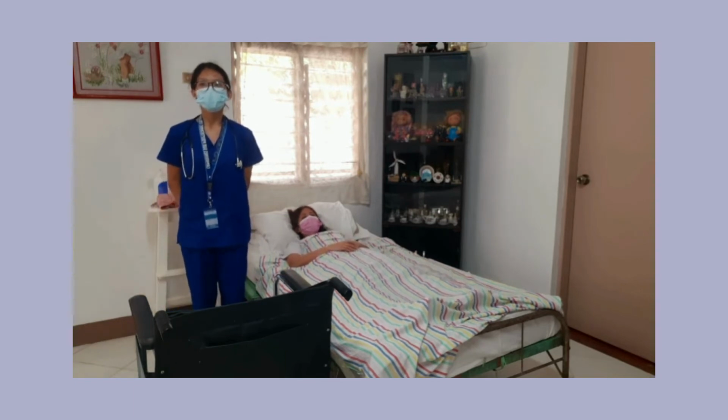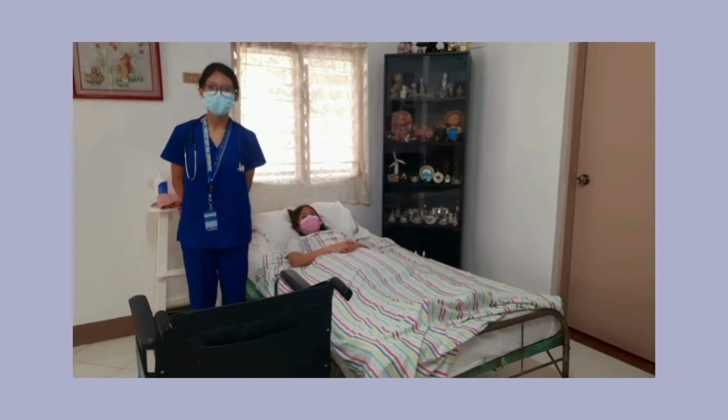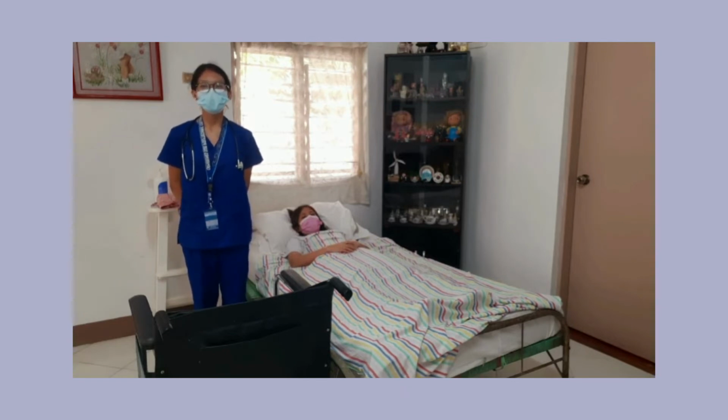Number 5, prepare and assess the client. Assist the client to a sitting position on the side of the bed. Then assist the client in putting on a bathrobe and non-skid slippers or shoes.